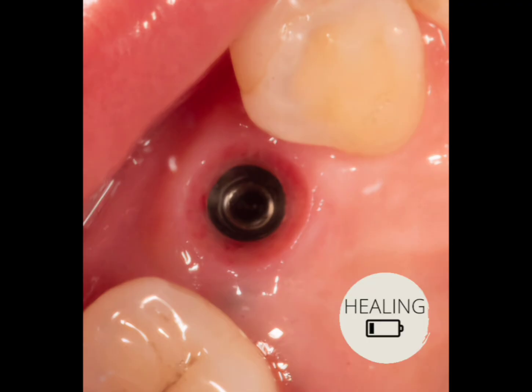Healing phase. The patient was recalled after 4 months. Clinical examination revealed satisfactory soft tissue healing. A remote crestal incision was made to expose the implant. The cover screw was removed and a healing abutment was placed.